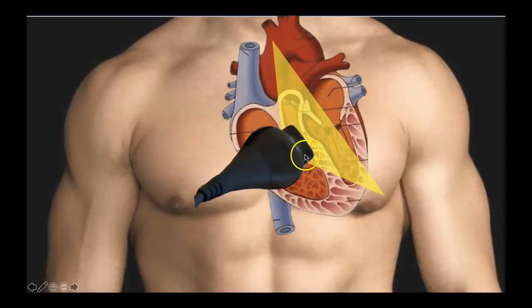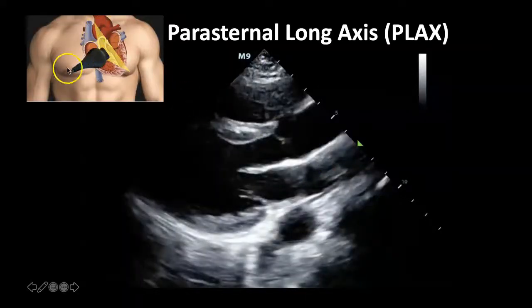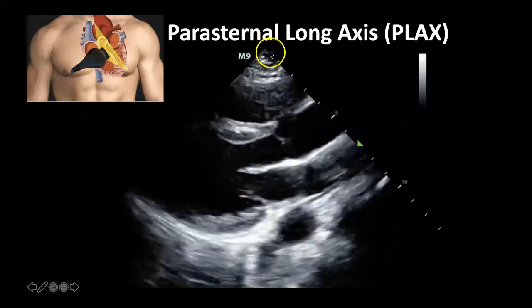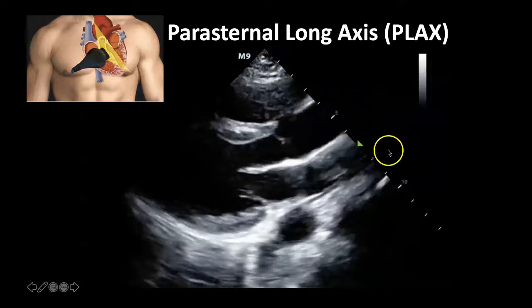In this parasternal long axis view, you're going to be looking at the long axis of the heart. To orient yourself on the image: the probe marker corresponds to the marker on screen, so one side of the screen is the apex of the heart and the other is the base. As with all ultrasound, the top of the screen is closest to the probe and the bottom is deep into the body. Depth measurements on the right side of your screen tell you exactly how deep you are — here's about 5 cm, here's 10, etc.